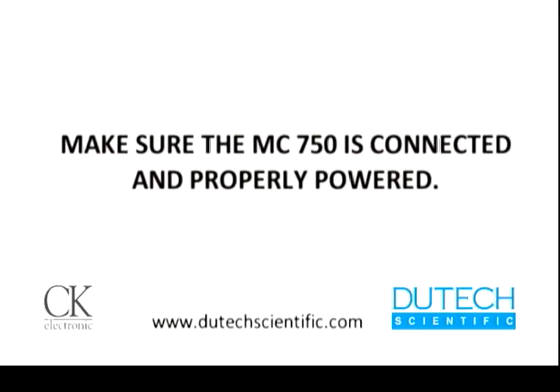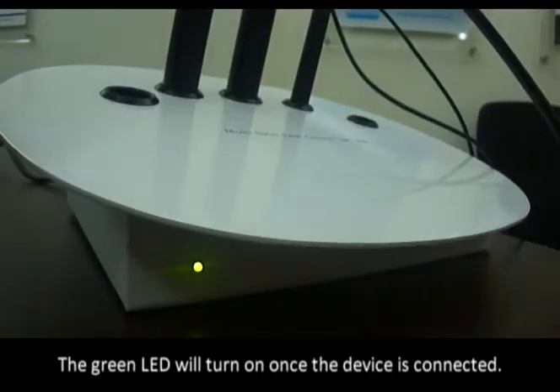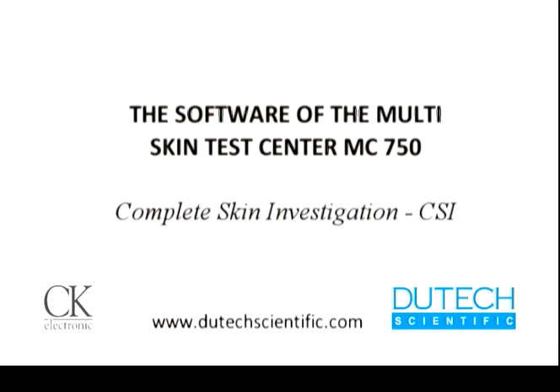Make sure the MC750 is connected and properly powered. The green LED will turn on once the device is connected. This completes the hardware setup for the Multi Skin Test Center MC750.